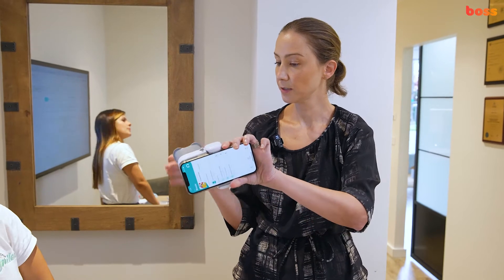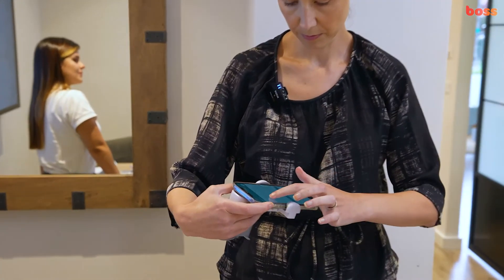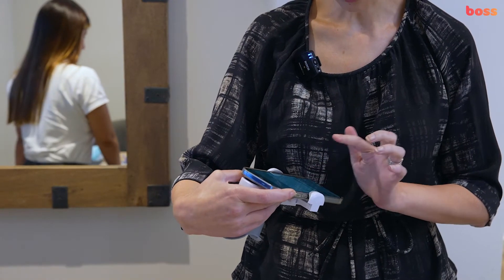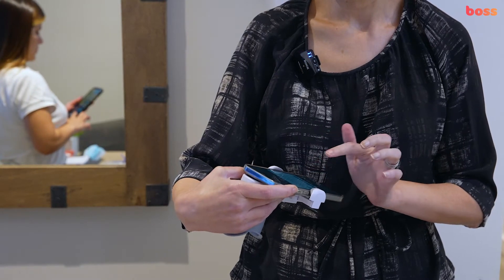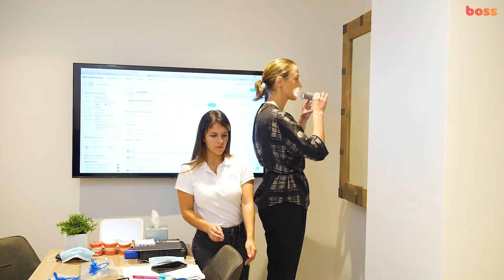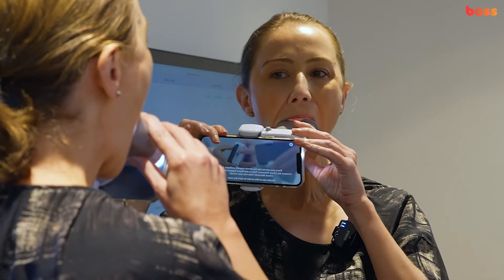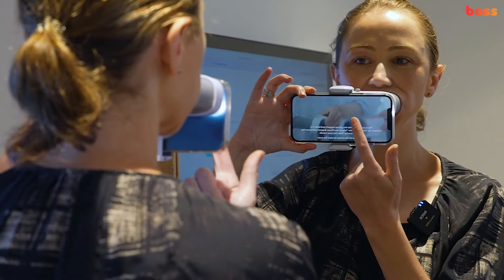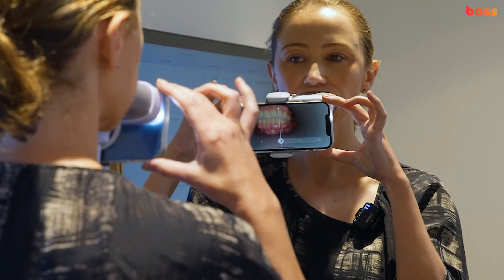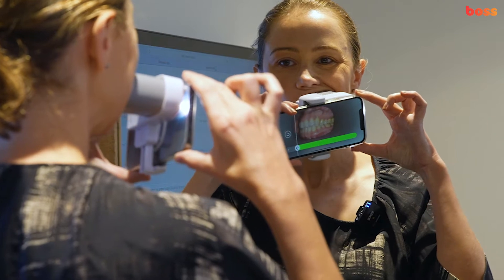It just clicks in easily. Then in the app, go to Demo, select 'Scan Box Pro', then hit 'Start Scan'. I'm doing a demo scan now standing in front of the mirror. The prompts guide you through: bite down on your back teeth and keep your teeth together, double tap to continue, then shift the scan box to one side, then the other side, then back to center.